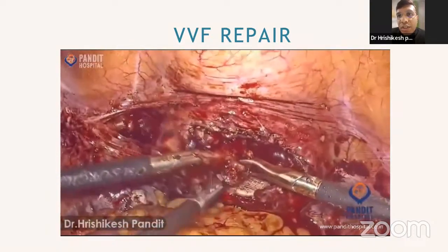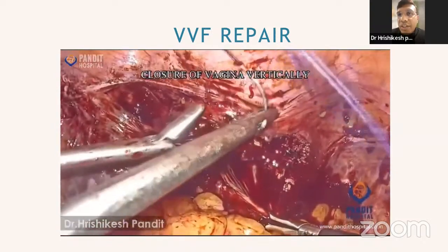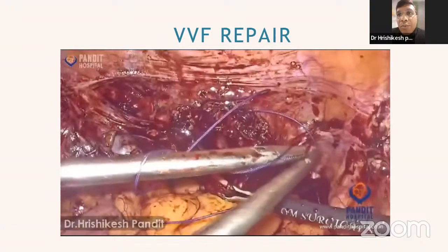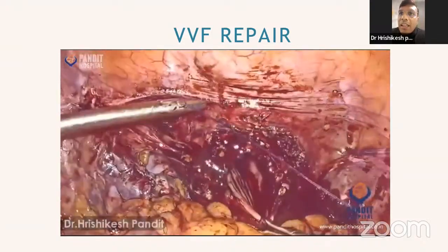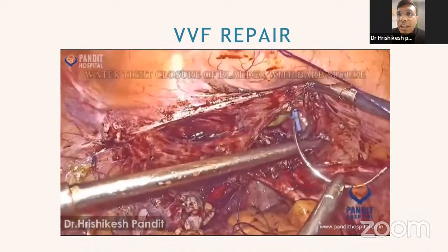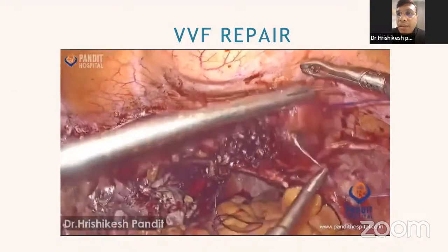The advantage of the transverse cystostomy is that you can easily and quickly reach the fistula tract. It is a smaller incision than the O'Connor technique. Then here I'm going to close the vagina vertically and the bladder transversely. So I'm showing you the closure of the vagina vertically. The intention behind that is to minimize the contact between the two suture lines.